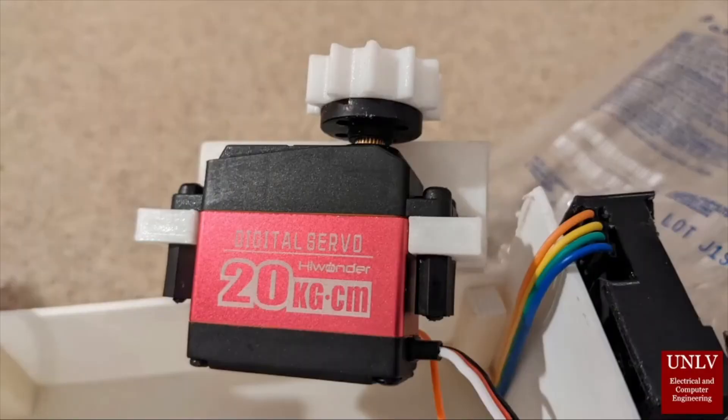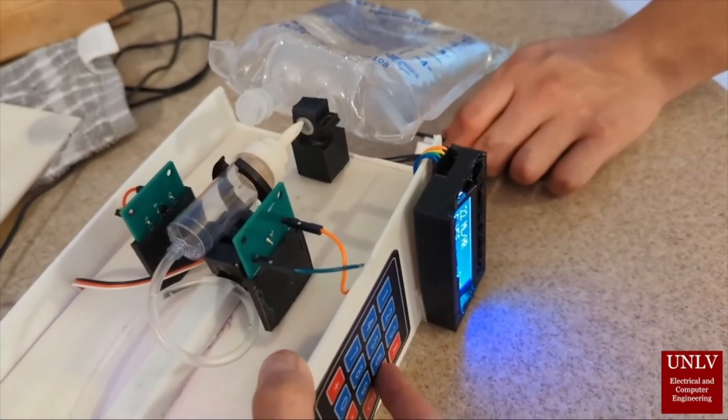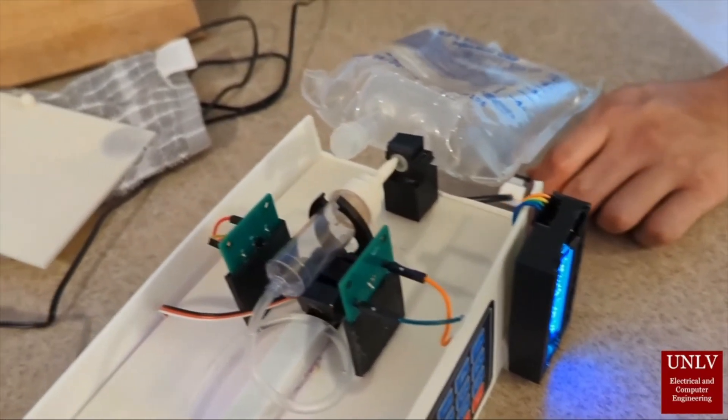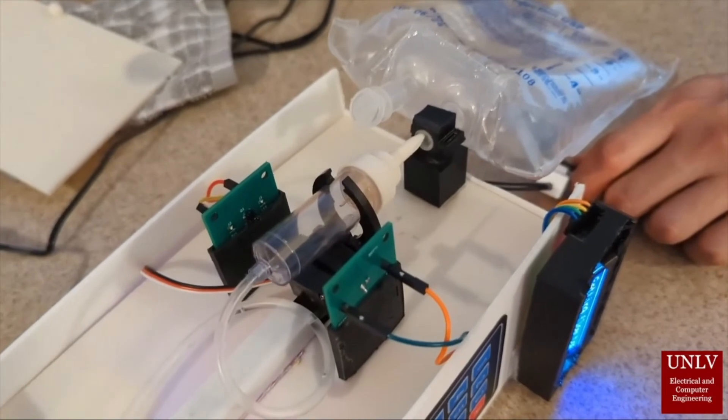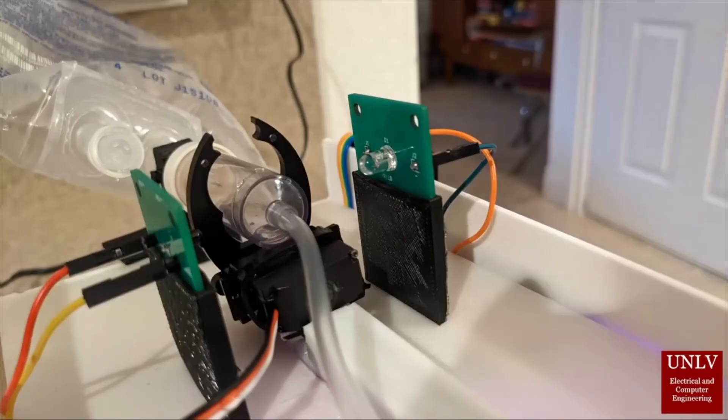This is our servo motor that moves through the gear railing — that is our auto spiker. You can see the gear that moves our claw, which is holding the drip chamber, as we saw briefly at the beginning of the video. Once you queue up the device, it will go ahead and spike the bag.